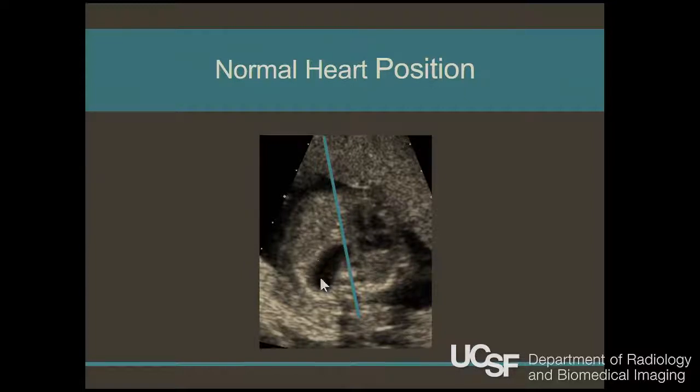If you didn't have the stomach here, liver and lung look pretty much identical. So if you have a bowel only or liver only congenital hernia, you're not going to actually necessarily see the mass, but you will see the abnormal cardiac position. So that's really the thing you want to focus on, more than just counting up and seeing that there are 4 chambers in the heart.